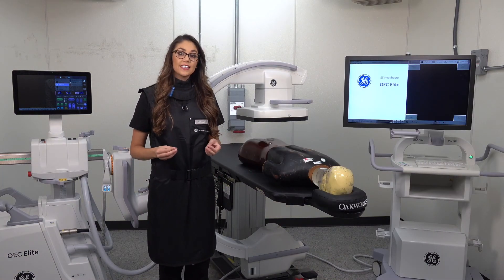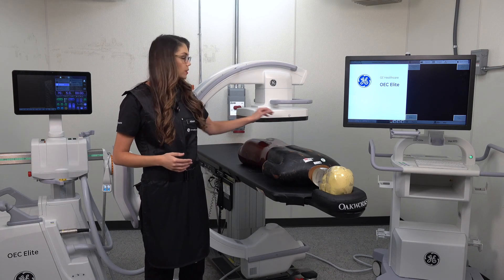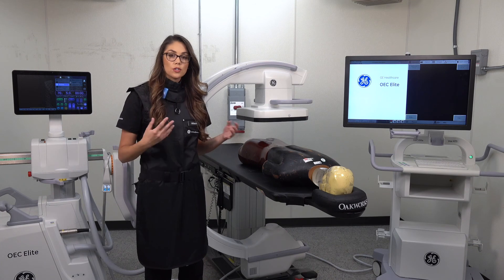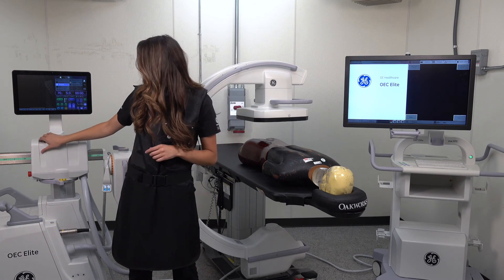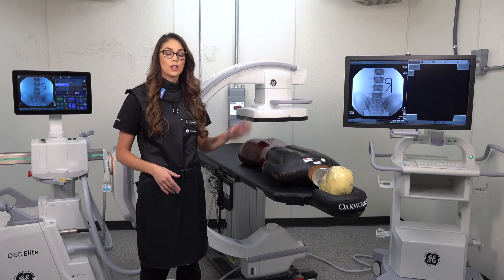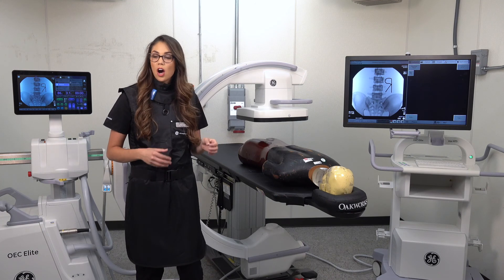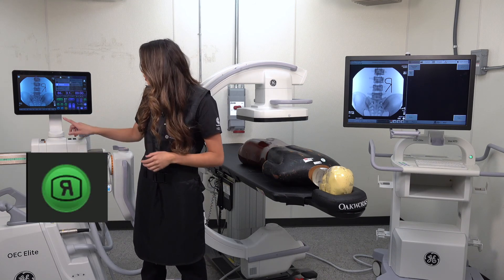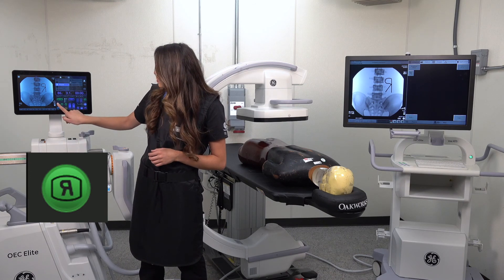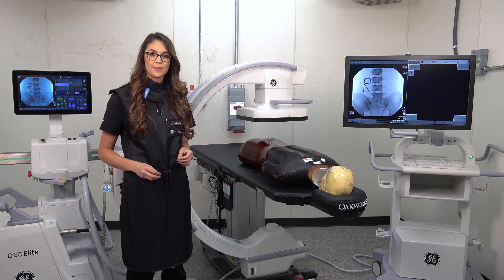For this case, our patient is positioned prone. Because of that, we will need to orient our image and I have a marker to help illustrate that. When I take my first picture, you will notice that the image needs to be flipped so that the right and left are displaying anatomically correct. On our touch control panel, you will notice that there is an R that is backwards. Once you select that icon, it will then anatomically orient your image.